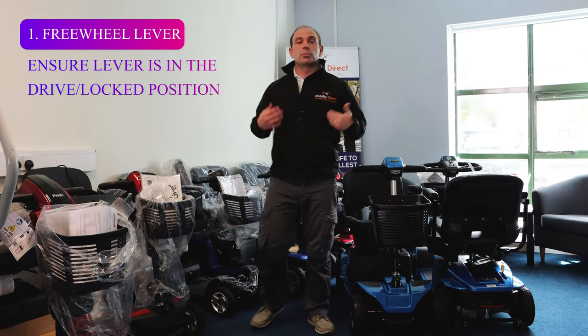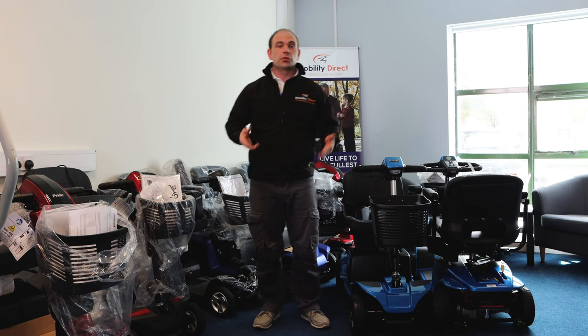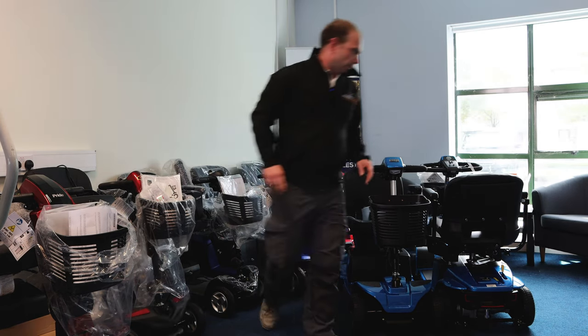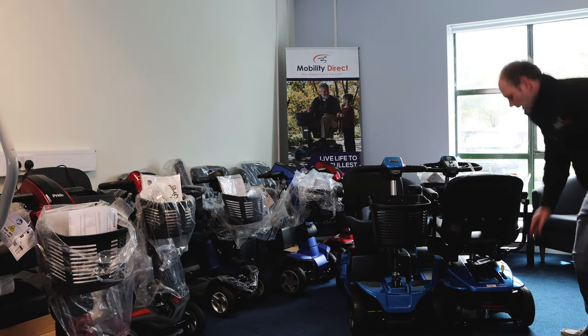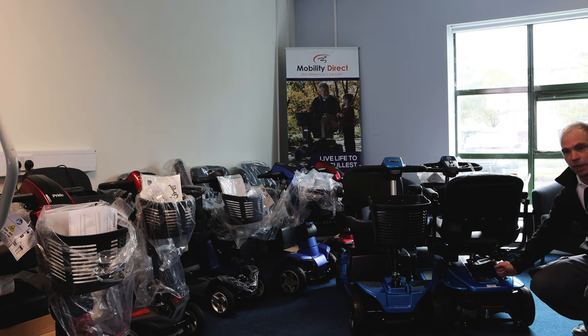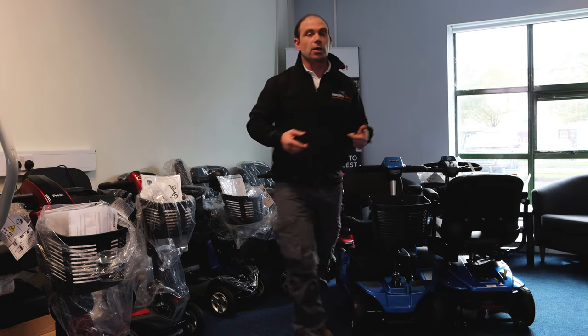What often happens is that if somebody wants to manually move the scooter, they'll put it into the freewheel position and then forget to change it back, and the scooter won't drive when it's in freewheel mode. We have one here — this is a Pride scooter, yellow lever, currently in neutral or freewheel. We pull it back and now it's in the drive or locked position. You then need to turn the key off and back on and that'll reset it.